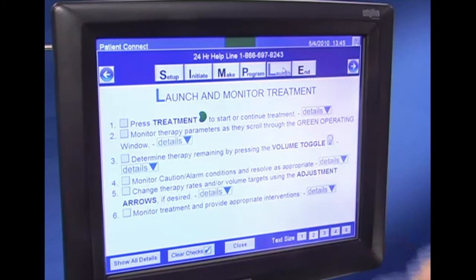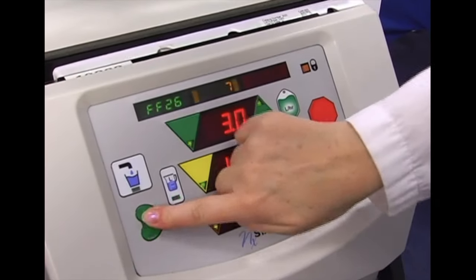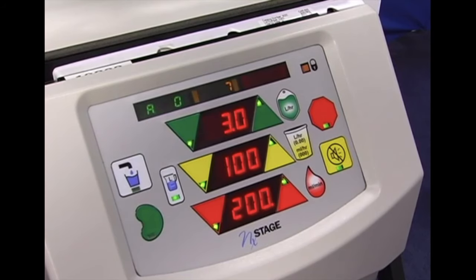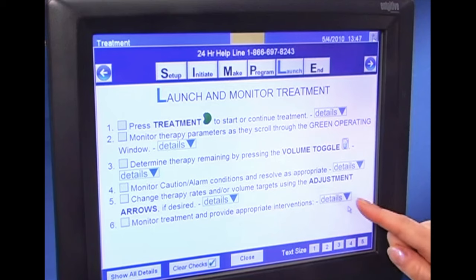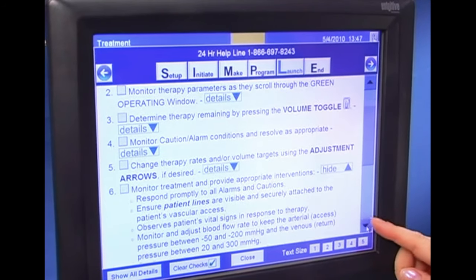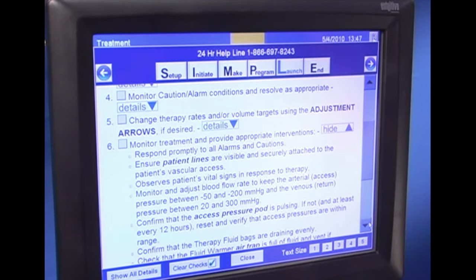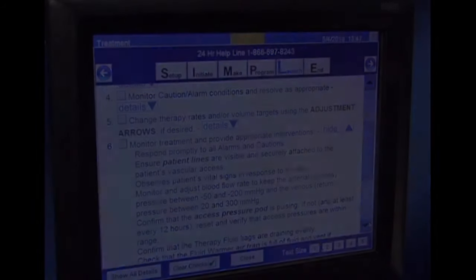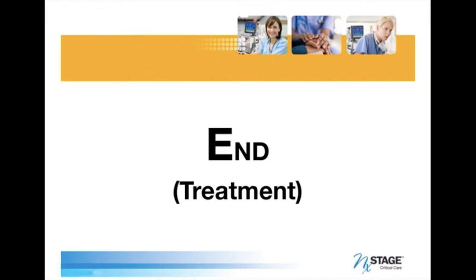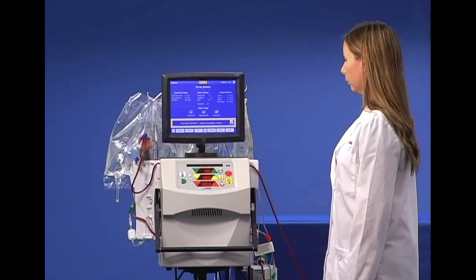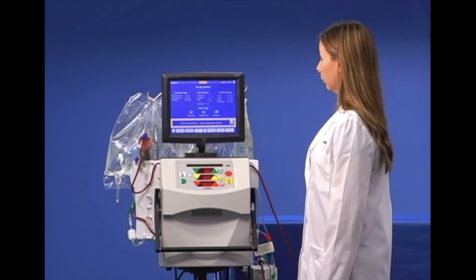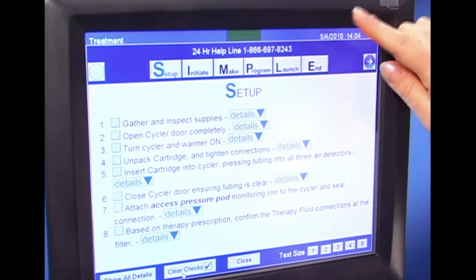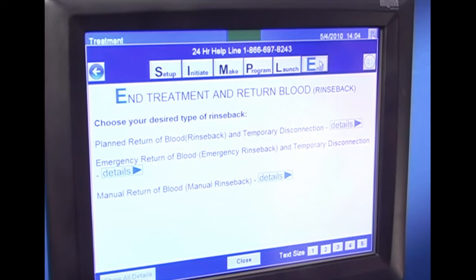Click on the launch button to learn how to start the therapy. Press the treatment key to start the treatment. You have successfully started the therapy. Refer to the detailed buttons in OneView for more information on monitoring the treatment. Monitor the treatment and provide appropriate interventions if necessary as outlined by your hospital protocol. To end the treatment and return the blood, click on the end button in OneView and choose your desired type of rinse back by referring to the end treatment module.